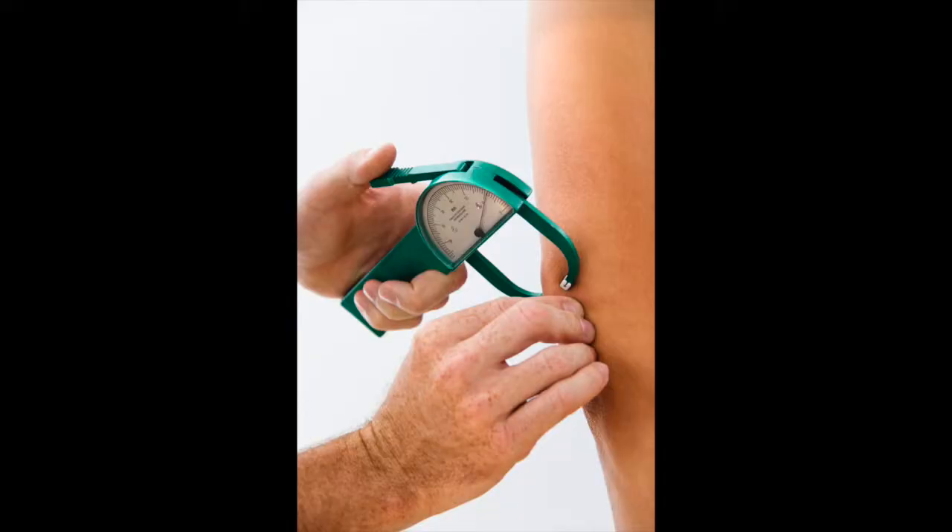Always make sure to take duplicate measurements, confirming that the new measurements come within 1-2 mm of the previous ones.